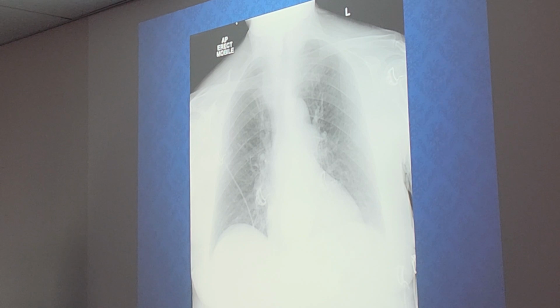Which means that the equipment needs to be configured in a way to send the correct numbers to the correct locations in DICOM. My suspicion is that these new machines, the portable machines, the new Philips machines, have not been configured to send exposure index values correctly to DICOM.